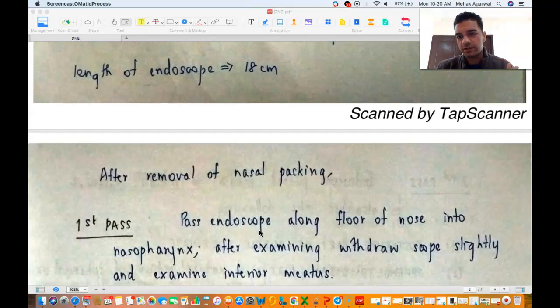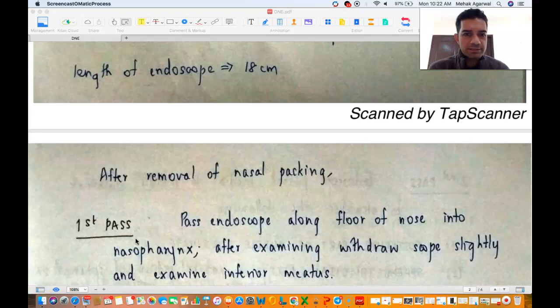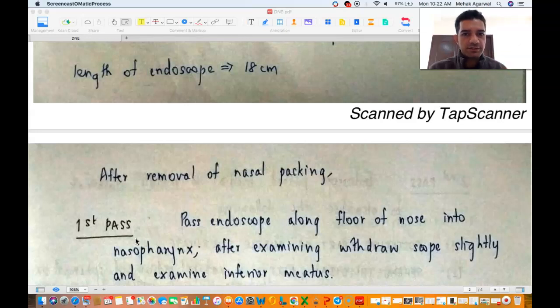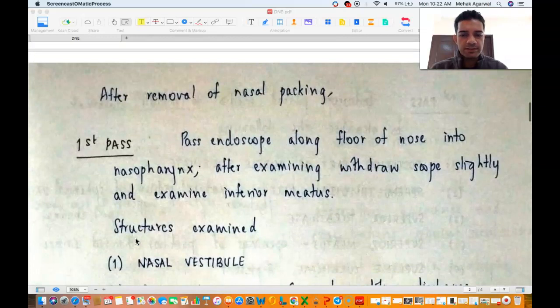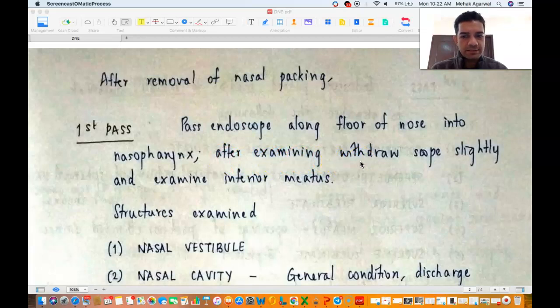You have prepared the patient, given adequate anesthesia, removed the nasal packing, and now you want to inspect the insides of the nose and see the nasal cavity completely on the left and right side. There are three different passes so that you don't miss out on any structure inside the nose, going in a very systematic approach. In the first pass, or inferior pass, you pass the endoscope along the floor of the nose straight into the nasopharynx. After examining the nasopharynx you withdraw the scope slightly anteriorly and inferiorly and examine the inferior meatus, then take it out.